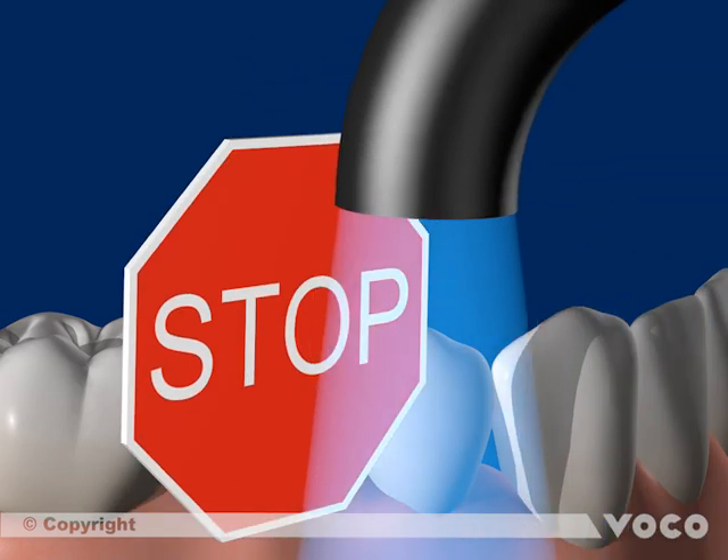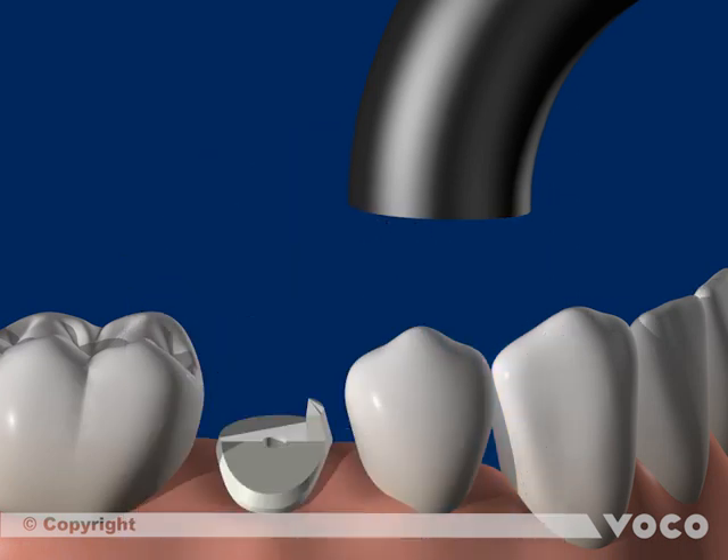Light curing the adhesive is not useful, since the specific geometry of the root canal doesn't allow light to penetrate to its bottom. Furthermore, the root canal might tighten, and especially in the coronal area, the fitting accuracy of the root post will be negatively affected if surpluses of adhesive material are light cured. Since Futurabond U is dual curing, a chemical cure in the root canal is guaranteed even without a polymerization lamp.